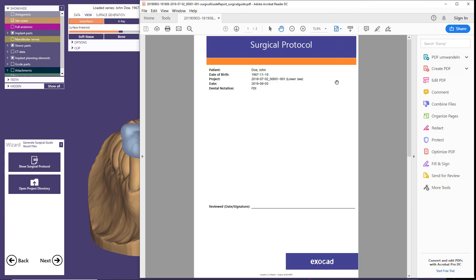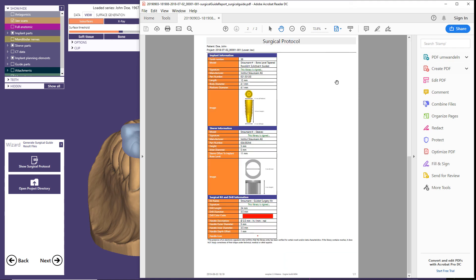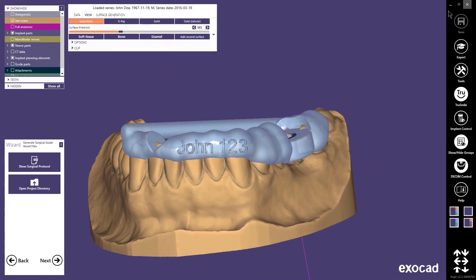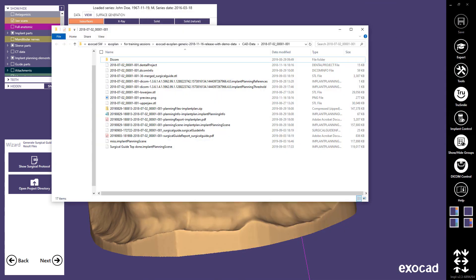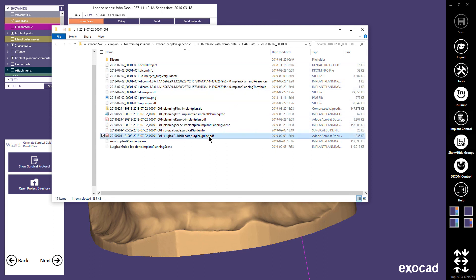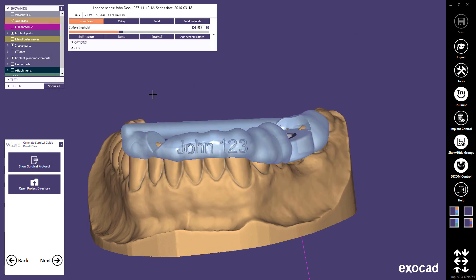The first page in the surgical guide report includes patient information. Thereafter follows information about the planned implant, sleeve and drill kit to use. The finished guide design is saved as an STL in the project folder. Verify the surgical guide manufacturing process and the surgical guide before using it for treatment of patients.